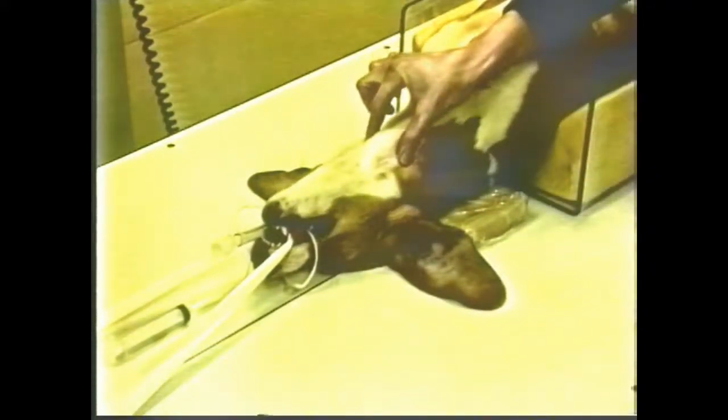Sponges may be used in the middle of the neck so that the middle of the vertebra is supported and does not sag. The exposure must be properly centered from the base of the skull to the thoracic inlet. The palpation of the atlas wings helps you. Markers, if you are coned down properly, may have to be placed on the animal rather than out at the side where they would not show.